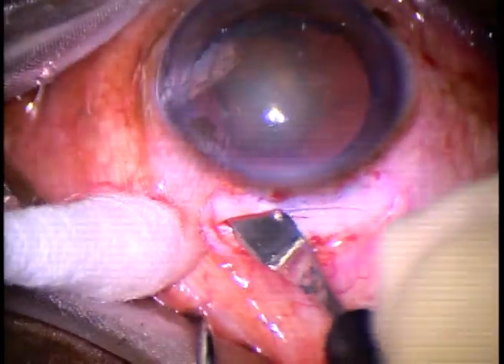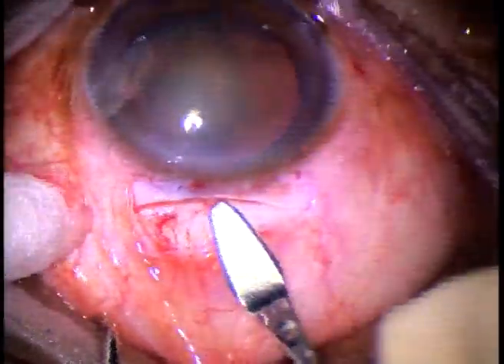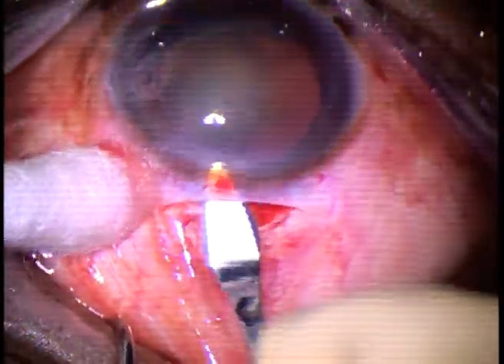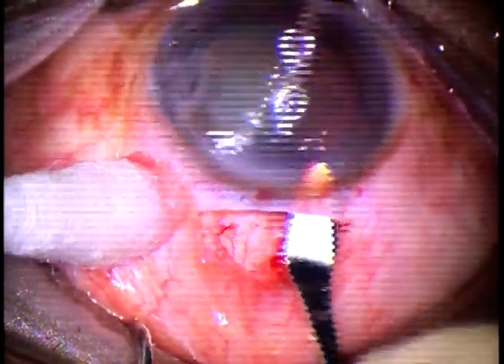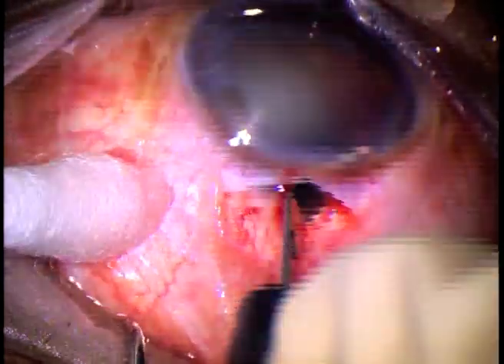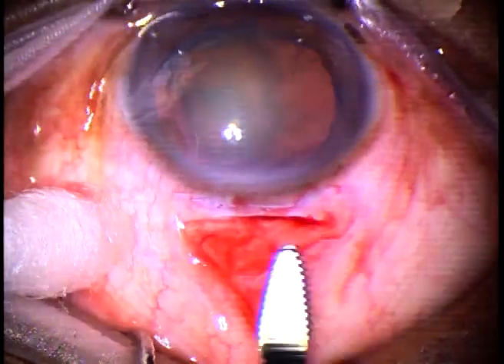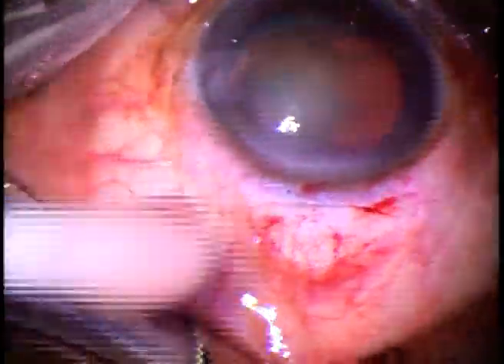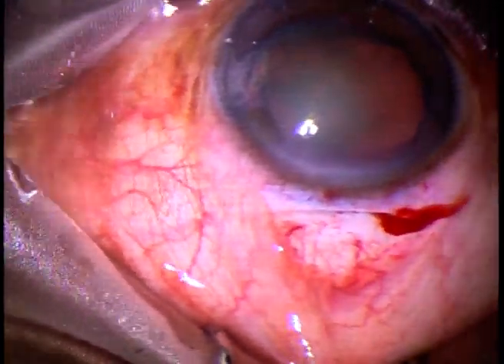The tunnel on the left side is made. Now the tunnel on the right side, sweeping backward and to the right. A very nice tunnel with good corneal valve is made.